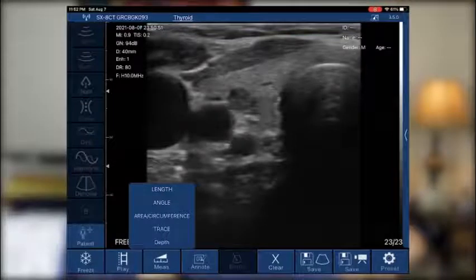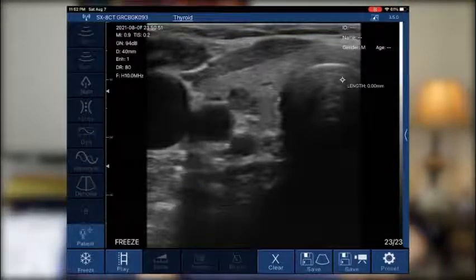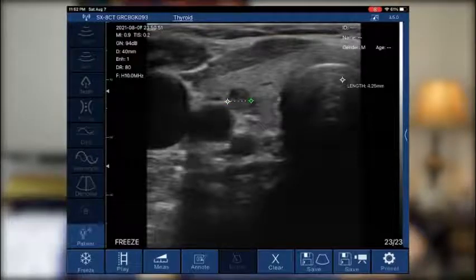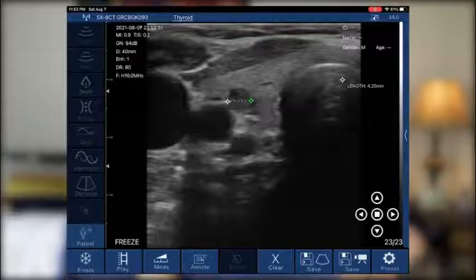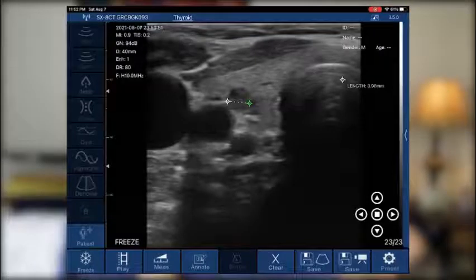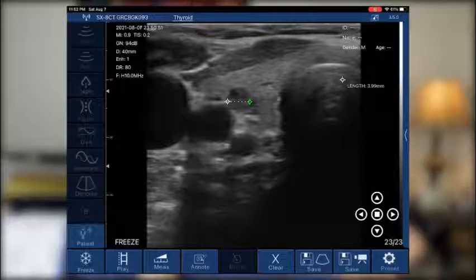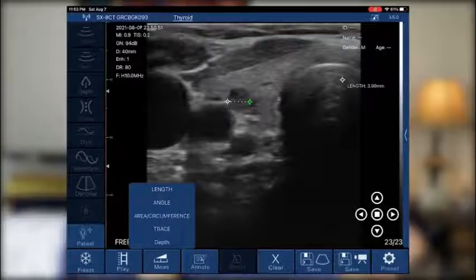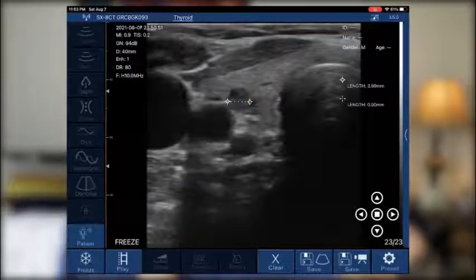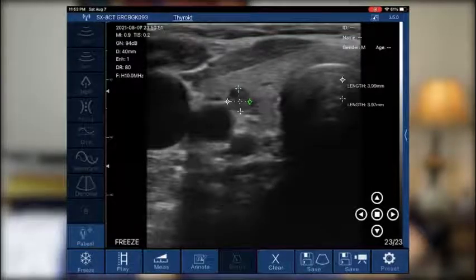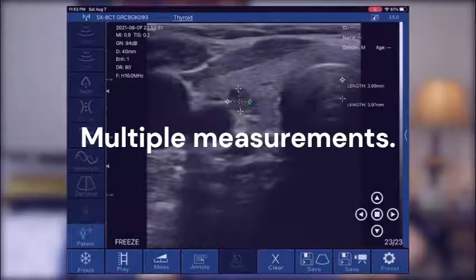I'm going to clear that. Normally we would measure the nodule, which is a lot smaller than the thyroid, so we can see how that does. It's actually very precise and measured end to end. If I wanted to fine tune, I can do that using my pointer finger and moving the cursor around. If I needed to measure the depth, I would just hit measure again, tap length, and carefully tap in the cursors.